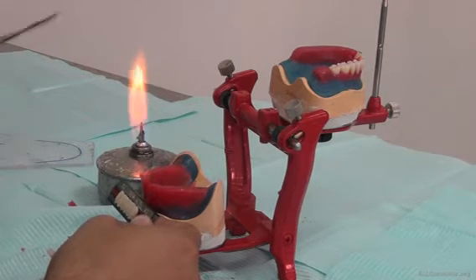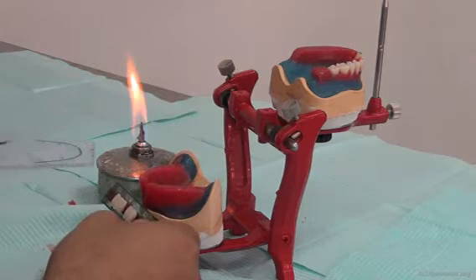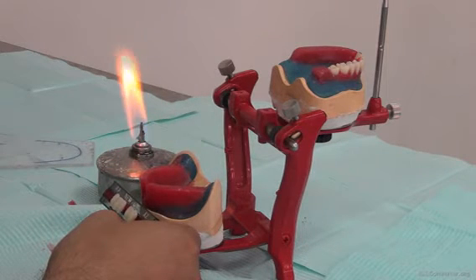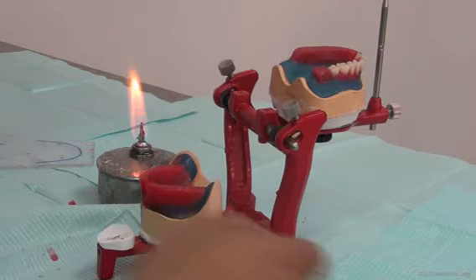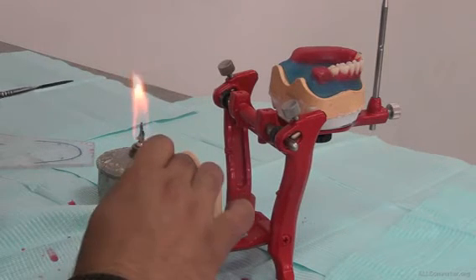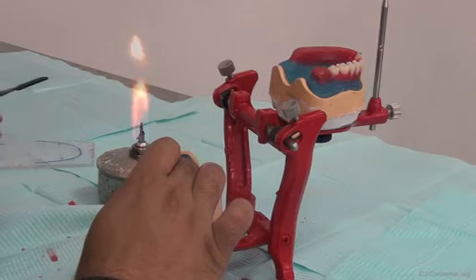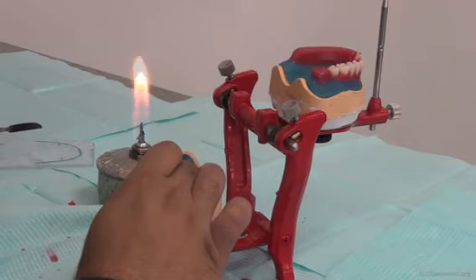Make sure that you take the correct tooth out, the first one right to the midline, and we're going to place it into location. And here we're going to observe all rules of setting. That includes the inclination of the root and the position of the incisal edge.